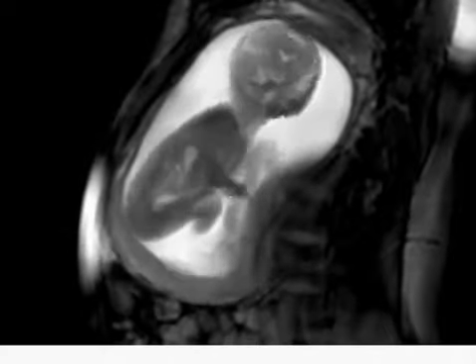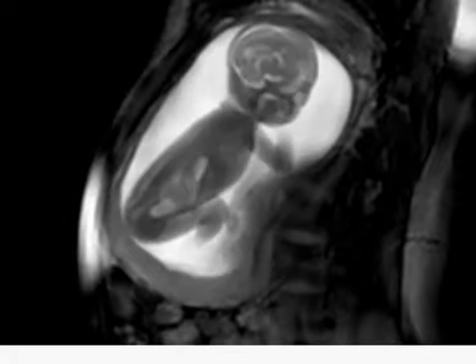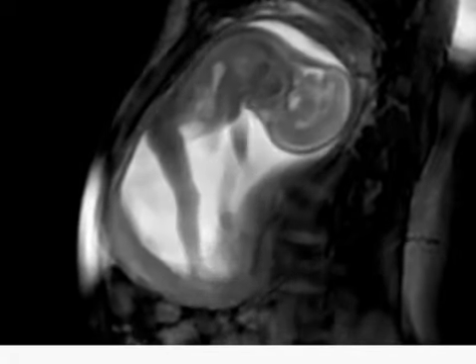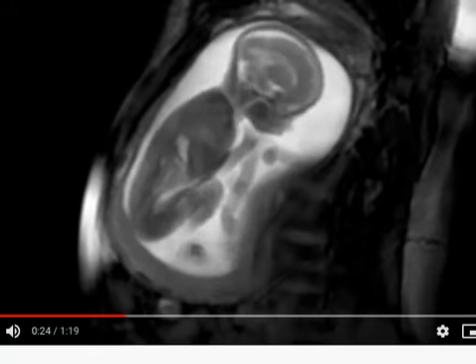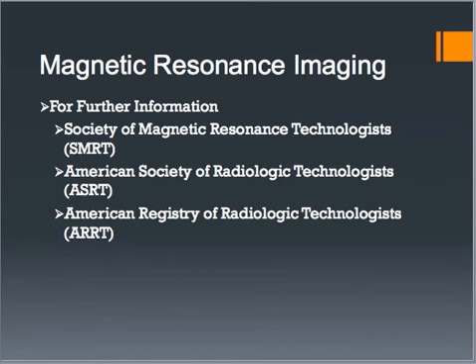So you can see it turning its head, moving its legs, its feet, arms. And it tries to almost stand up or stretch out. And then it just kind of repeats itself. But I think it's really neat to be able to see that baby moving in there and see the structures within.